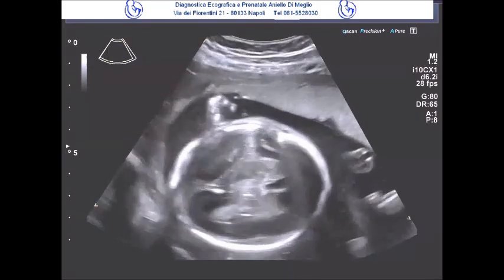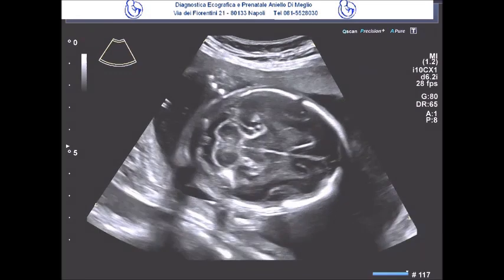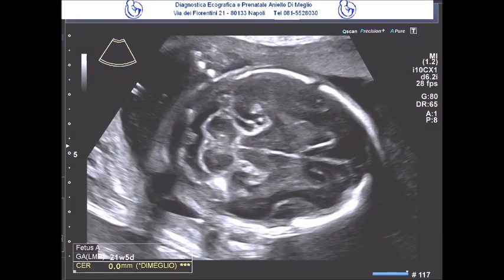The rest of the anatomy appears regular. We see a small choroid plexus cyst, which is not clinically significant in itself, a contralateral ventricle near the probe, which is normal at 8 millimeters, and a normal posterior cranial fossa.